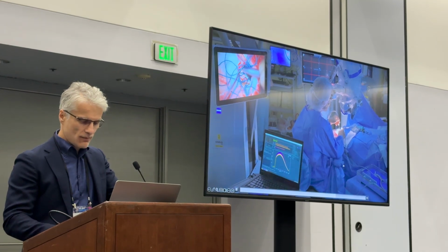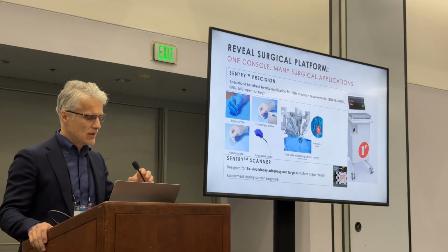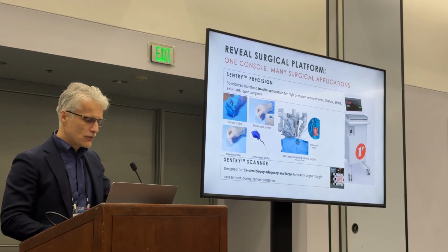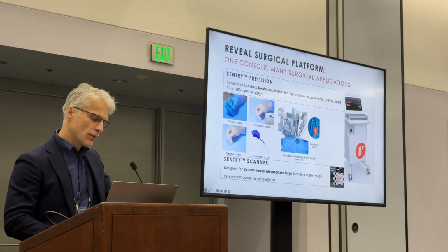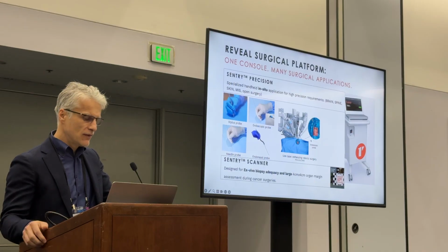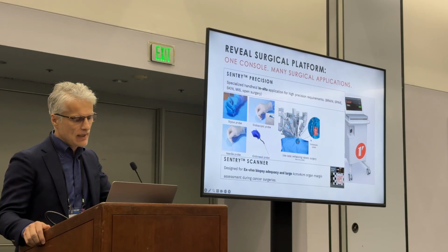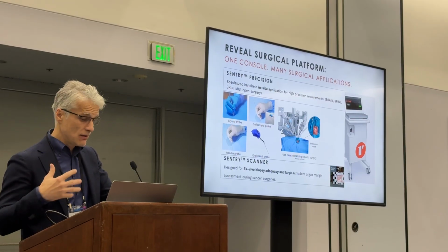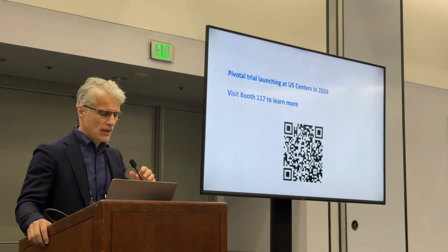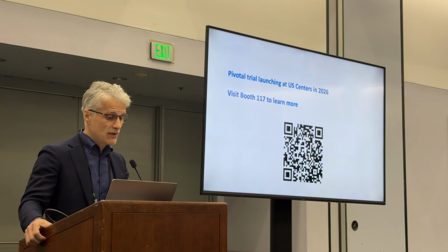I will move from there. The stylus is one device. We've developed other devices as well that could be used for endoscopic surgeries, transnasal surgery. So this is an endonasal probe. These are examples of the device being used in robotic surgeries for GU and other types of abdominal surgeries and thoracic as well.